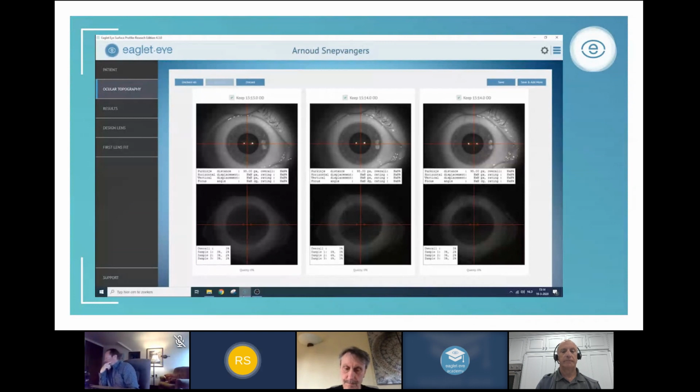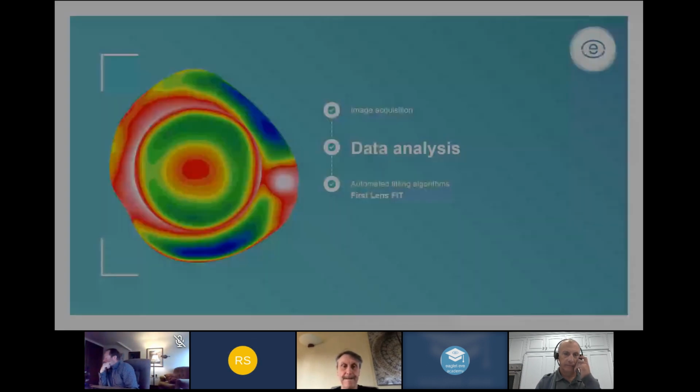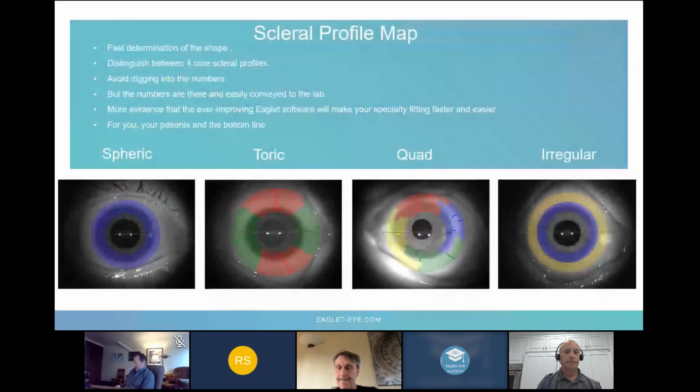Okay, I will move on to the next topic. That's the video again. So, data analysis. First of all, the scleral profile map. This is a map we introduced last January at the GSLS in Las Vegas.